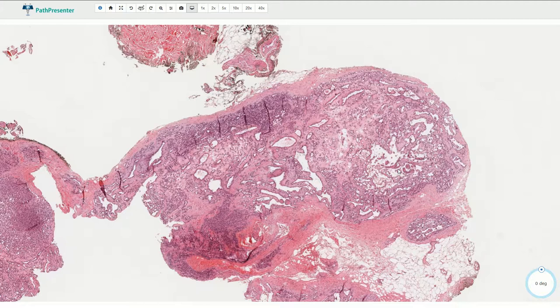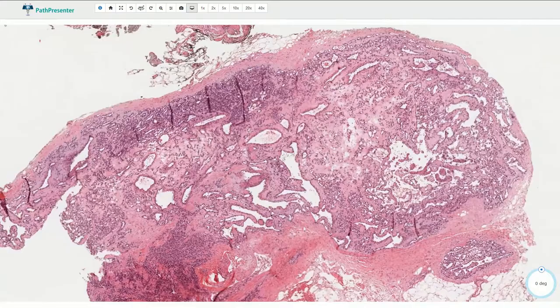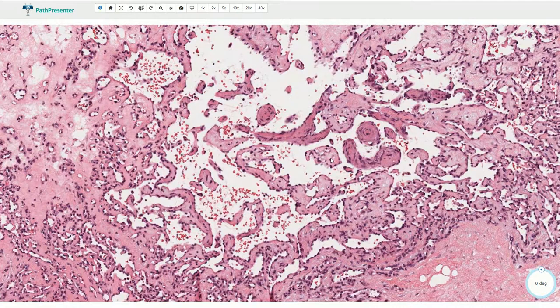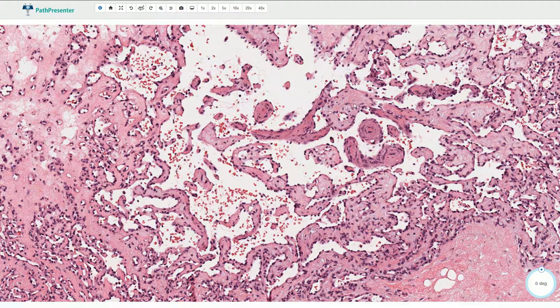The lesion is typically well circumscribed and has a fibrous pseudocapsule. Here we have multiple irregular vascular spaces, and on higher magnification we can see the typical papillary proliferation, which is lined by a single layer of bland endothelial cells. The papillary structures have a fibrous core and the endothelial cells are flat and benign-looking.